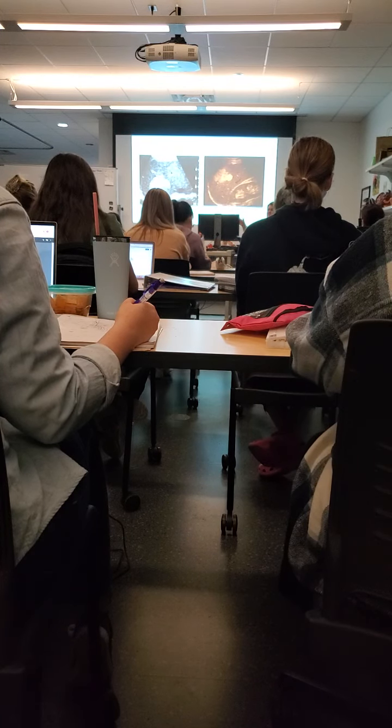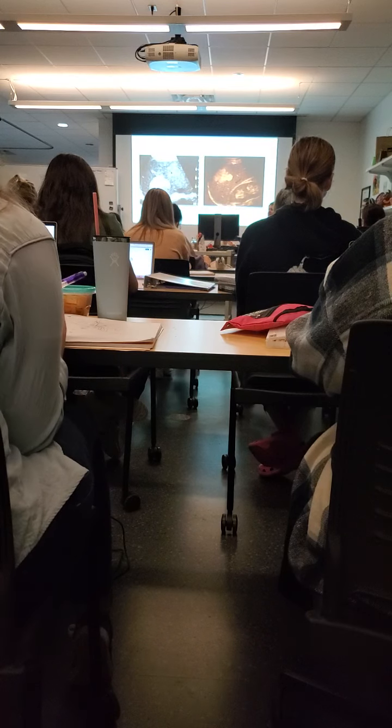All right, let's look at the other one. I gave it away, right liver lobe. This is a sagittal. How do we know it's sagittal? Can anybody tell me? This is advanced, so you're not supposed to know this. The kidney. The kidney is in a sagittal position, so yes, that's how I figured it out, right? And that's just another slice.